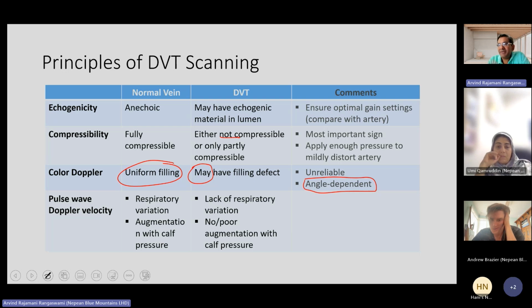However, when you're choosing the vascular ultrasound settings, there is an automatic angle correction that is applied by the machine. The other thing you can do is change the angulation of your transducer such that you create a 30 or 40 degree angle to the vein in order to get the flow. Then you apply pulse wave on the vein.